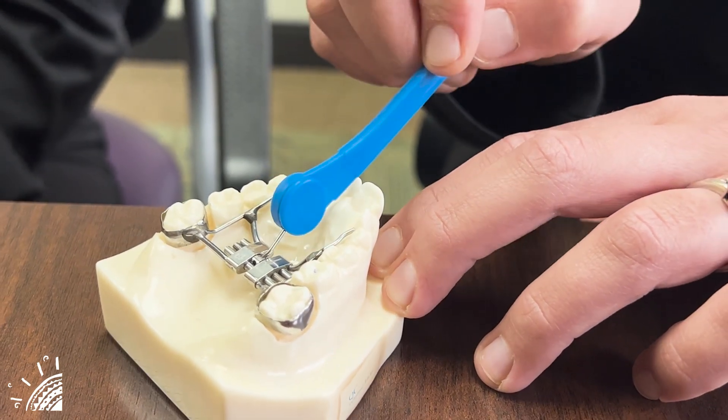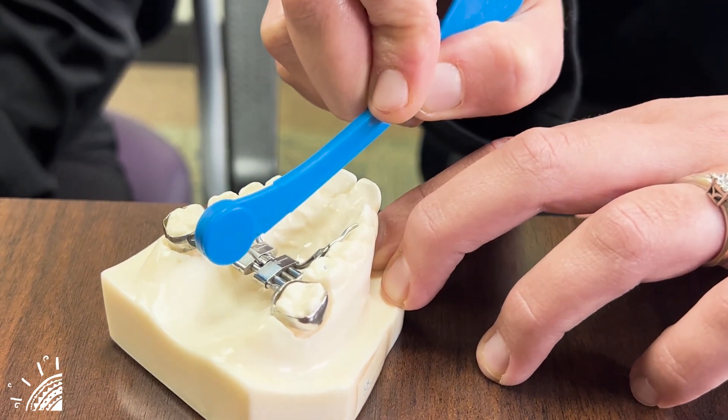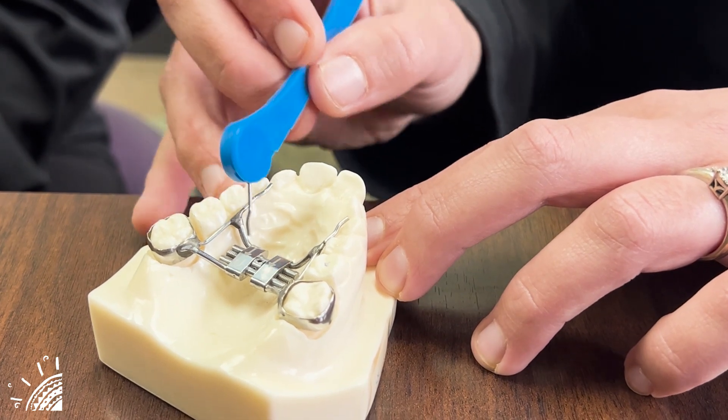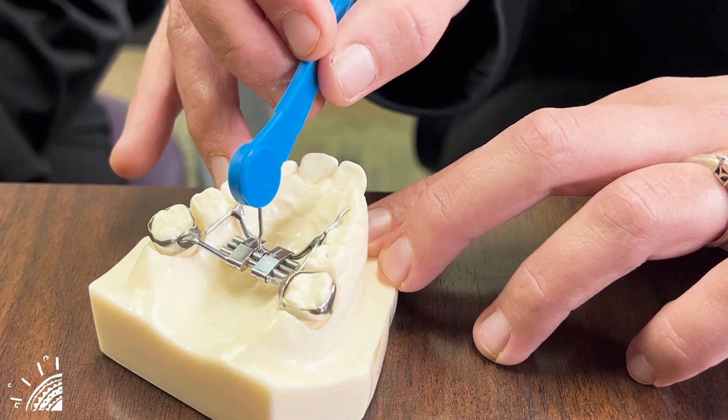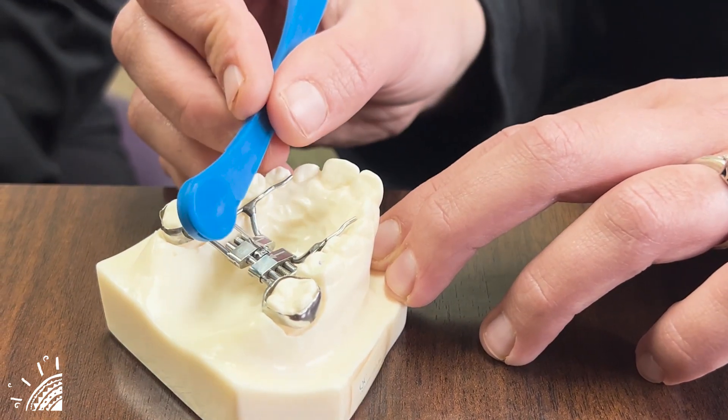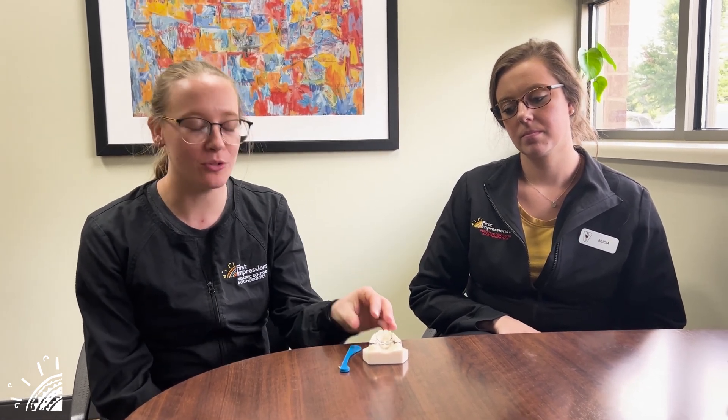If you go to turn the expander and accidentally turn it back partially, that could allow the next hole not to reappear. If you run into this instance, put the key back in and complete the turn from the previous day so that the new hole reappears. One of the most common concerns is that next hole not appearing. You can often find it just by wiggling the key around to find that hole and then completing that turn to find the next hole.